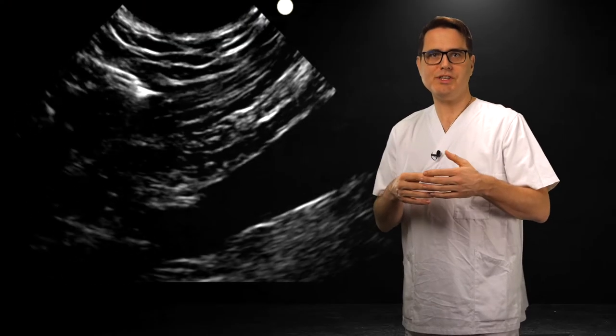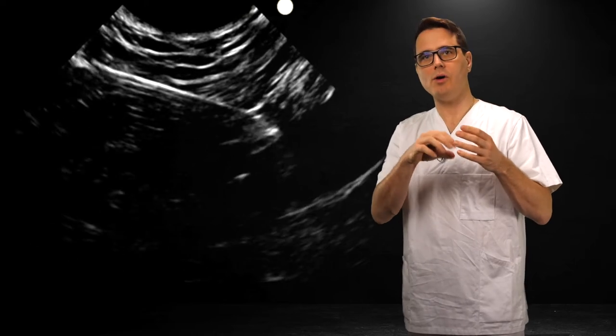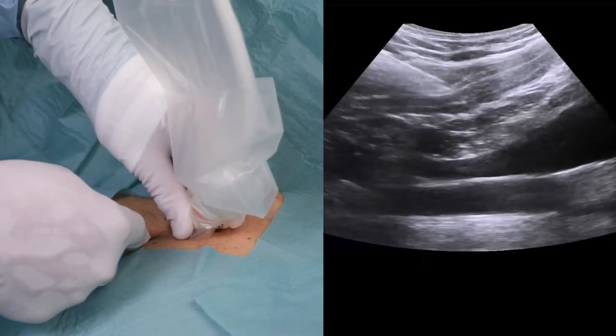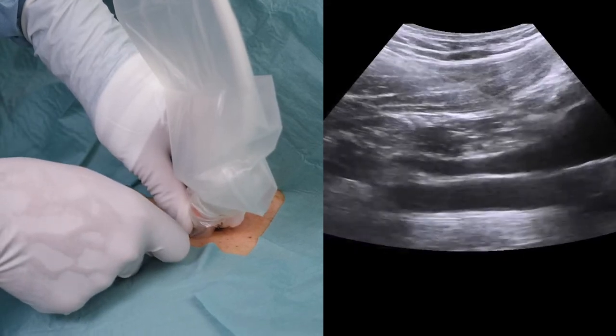What we want to achieve is a perfectly aligned, perfectly parallel cannula and ultrasound beam, approaching a long axis view of the vessel, seen as a beautiful black band in the right part of the screen, which is where we aim to hit the vessel with the cannula. We've inserted the cannula in-plane with a clear visualization of the tip. See how we proceed towards our target with perfect control.